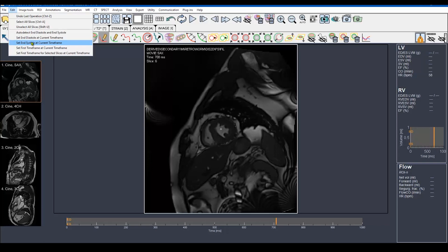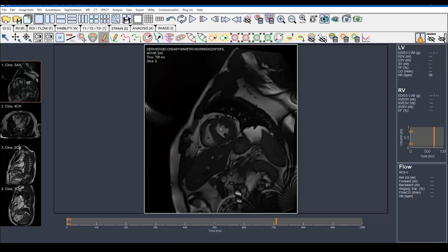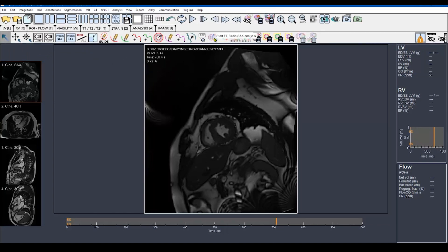Actually, this step is not an essential step in performing the strain analysis — the software will calculate the strain analysis either way — but it's a very important step to select the slices we are going to work on, especially the basal slices. In order to understand this, I will just ignore this step and move directly to the next step, which is Strain and then Start Feature Tracking Short Axis.